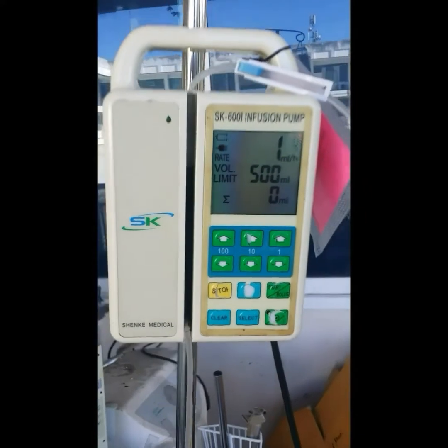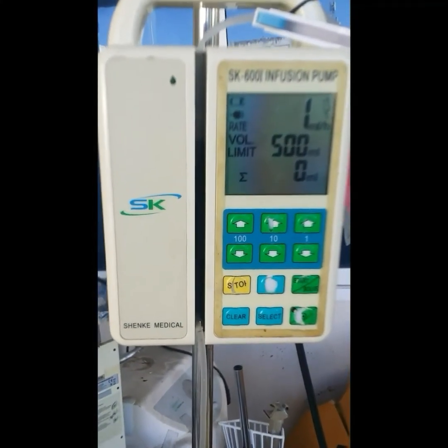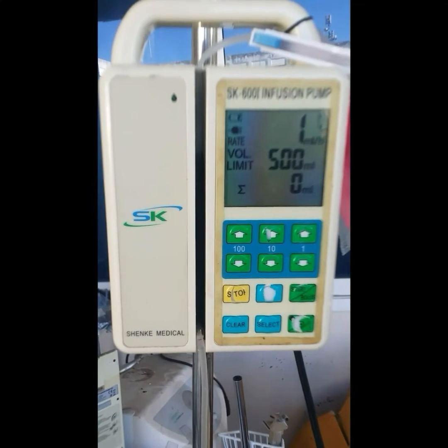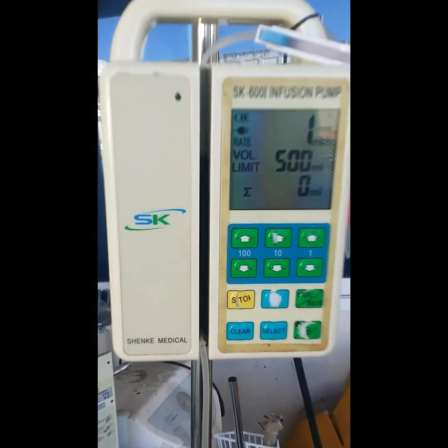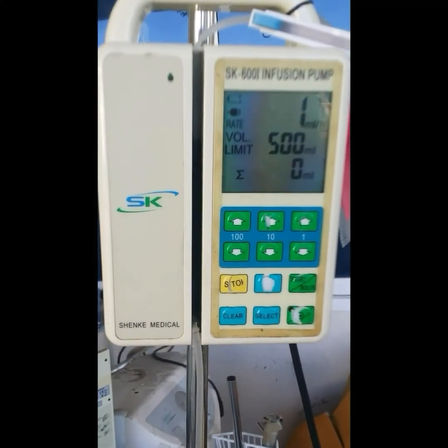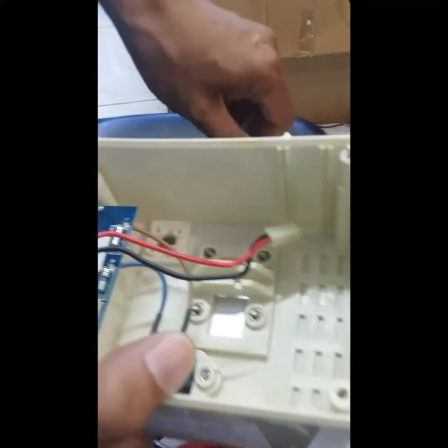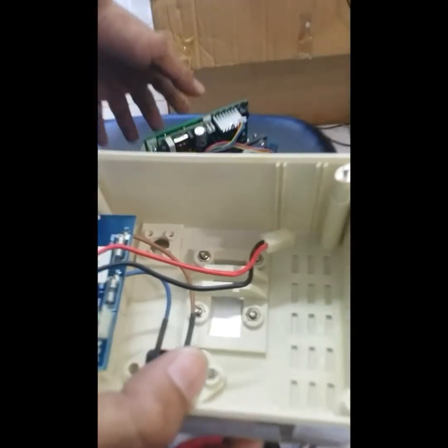But before that, make sure that you know what you're doing. If you don't know what to do, please don't try to open it up by yourself. Also make sure that every time you check the infusion pump, it must be calibrated. Then open the cover of the infusion pump.